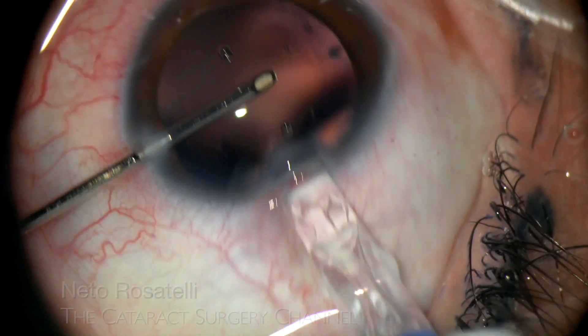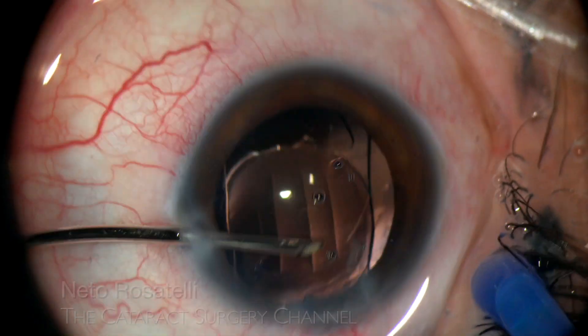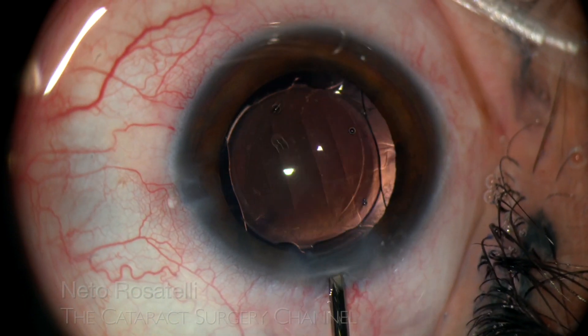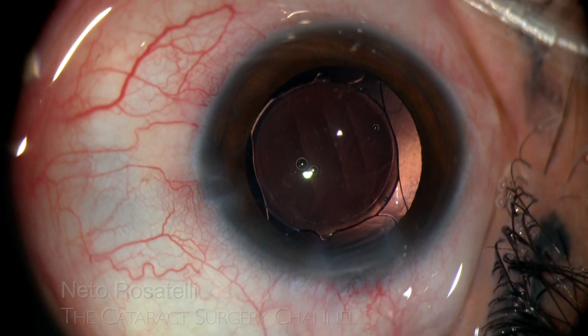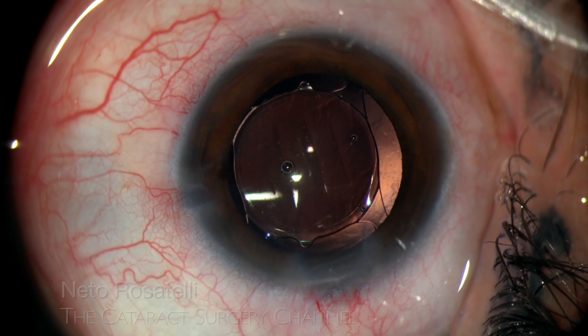In this case, the IOL hydro implantation technique shows its value as an extremely efficient and fast surgical step, leaving no OVD behind. IOL centration is ensured, and then stromal hydration seals the incisions.